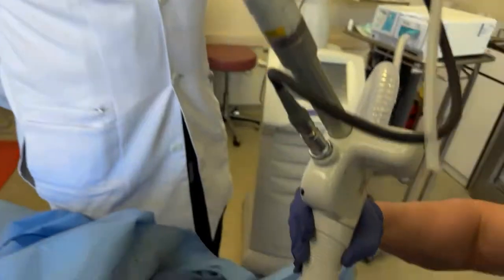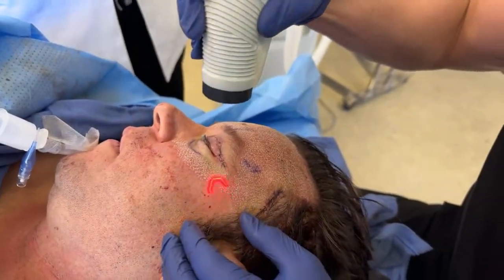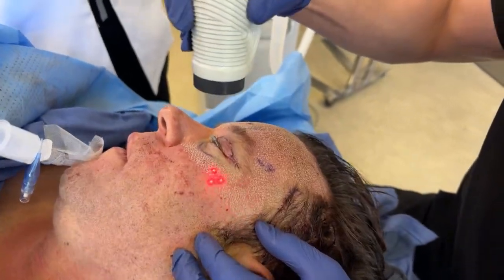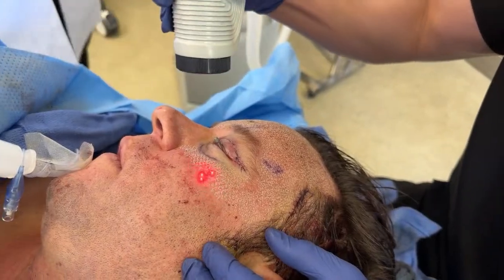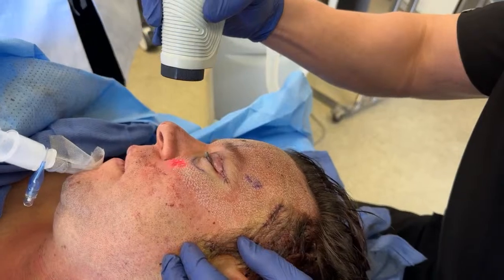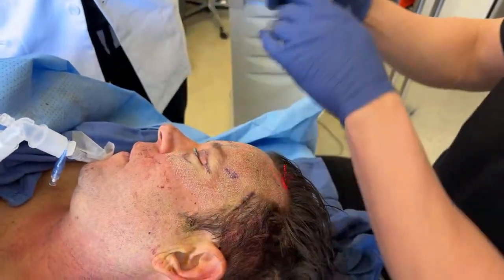So that's what we're gonna do right now. It's very important when you guys are doing lifting surgery to combine the lasers. I'm gonna do a little bit here in the eyes and then finish the rest of the face so you guys can see. The lower portion of the eye is where people notice a lot of their sagging and the hooding in the upper portion. So what we're gonna do to find wrinkles.